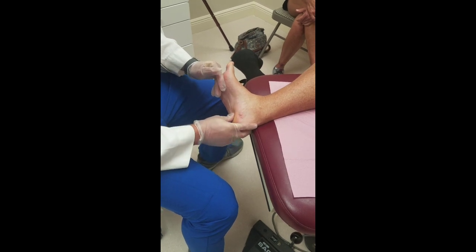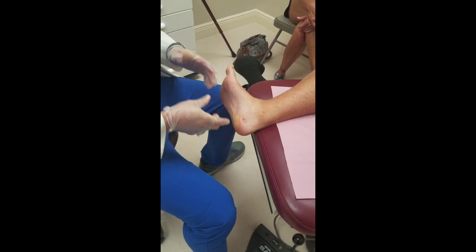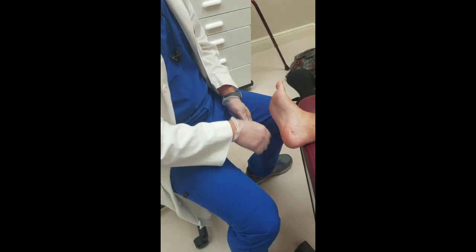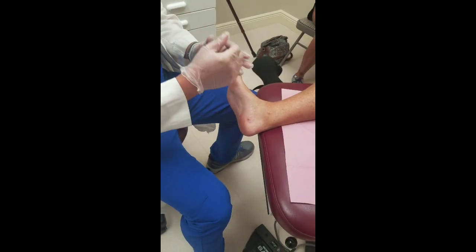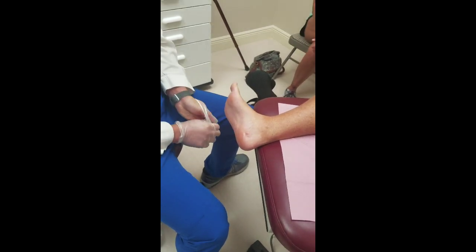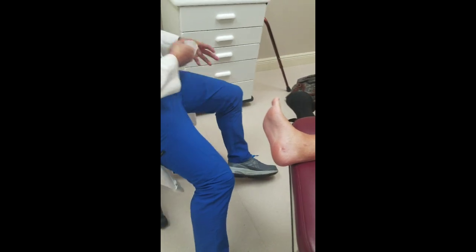I don't feel that inflamed plantar fascia anymore, because we saw it on the ultrasound when we were debriding and cutting it out. Are you going to check with the ultrasound or not? Not today. We don't need it. When we did the procedure, the ultrasound was what guided the needle, to break up that scar tissue and the inflamed tissue. I'm very happy with your progress. Yeah, I am too.